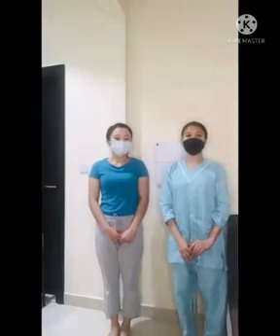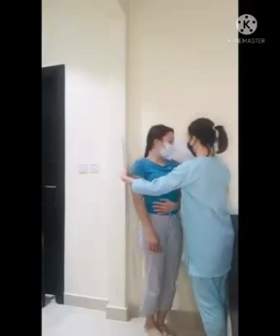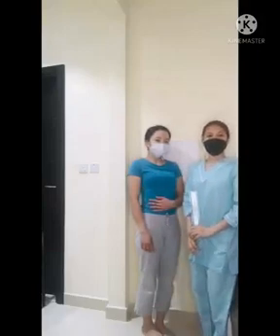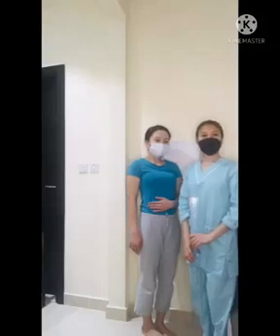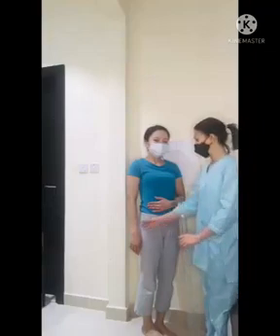The second projection is the AP oblique projection, Grashey method, glenoid cavity. So, the patient's body is rotated 35 to 45 degrees towards our affected area. So, the center is the mid-scapulohumeral joint to IR, slightly abduct, arm flex, neutral rotation.